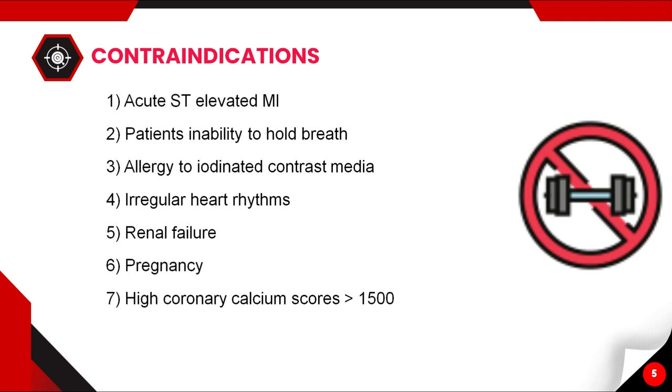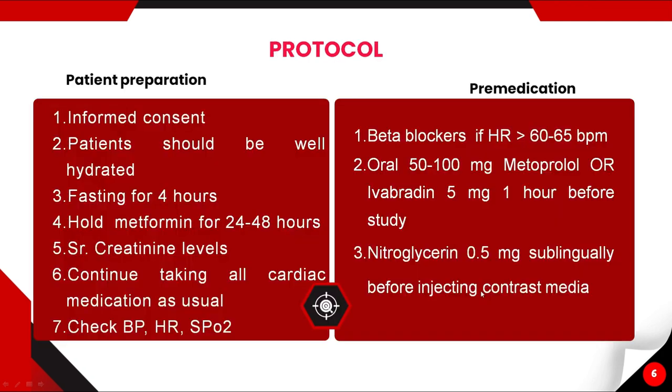For CT coronary angiography, the protocol used is as follows. We have to prepare the patient, take the informed consent from the patient, and the patient should be well hydrated and fasting for 4 hours.